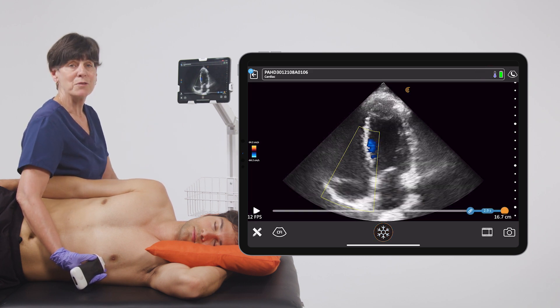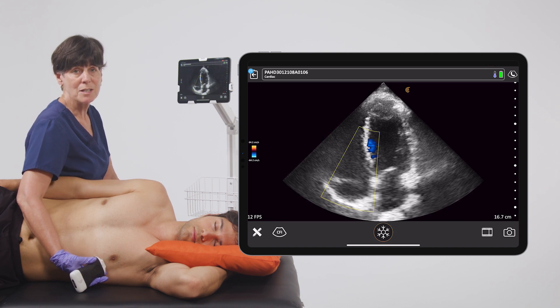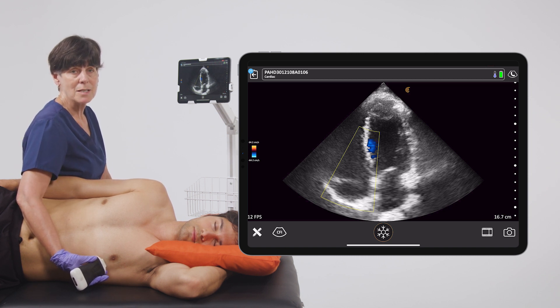The apical four-chamber view provides lots of valuable information about the mitral and tricuspid valves as well as the function of both ventricles.